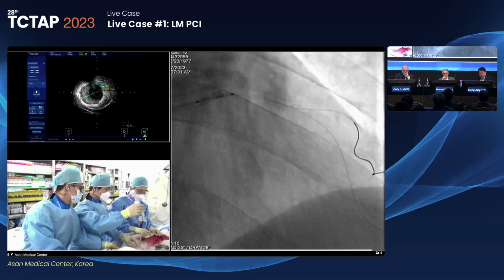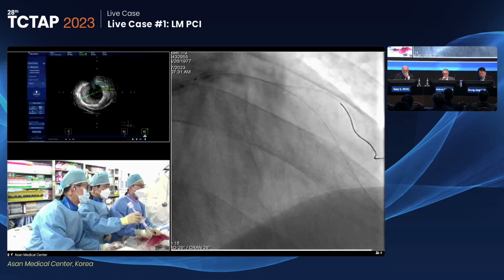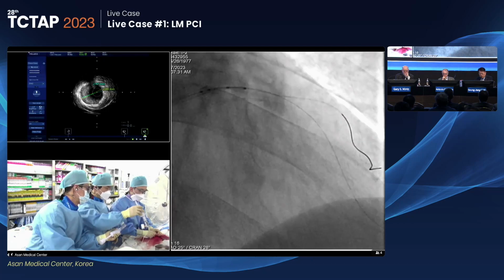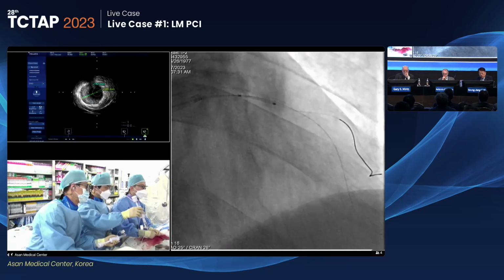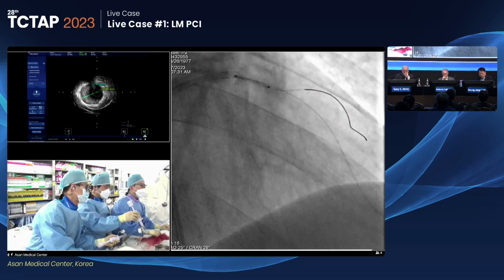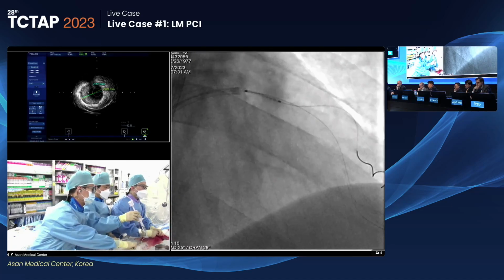We need more power. Okay, push in. Yes. Why not? Slowly. What is that? Yeah. Listen. Way in. Okay, good. Proximal vessel.